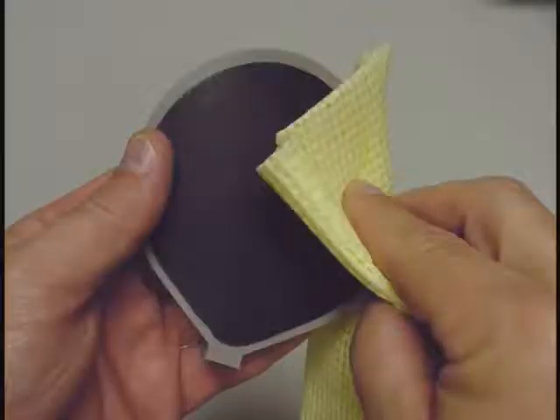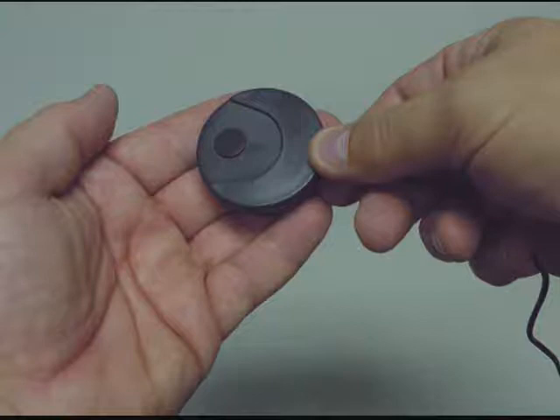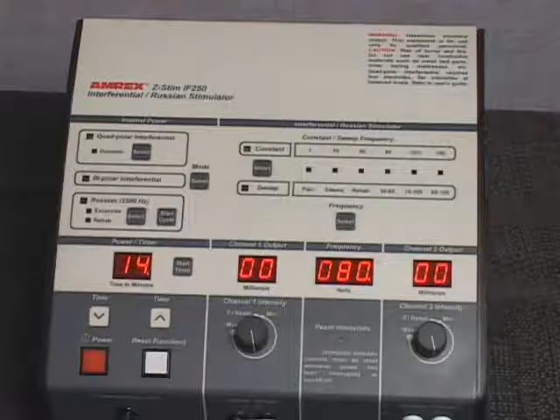Prepare the pad electrodes and apply them to the patient. The pad electrodes may be held in place by means of retention straps or weight bags. Hand the patient treatment stop switch to the patient and explain its function. When the patient treatment stop switch button is pressed, stimulator output will be discontinued immediately.